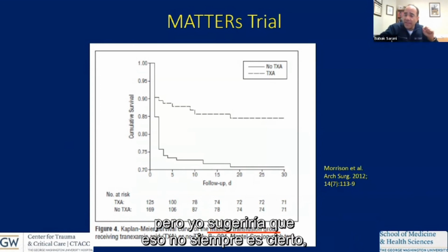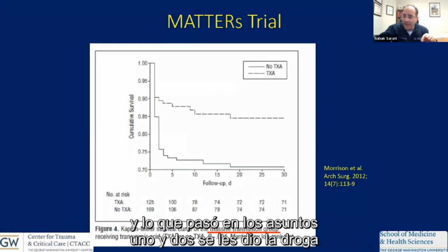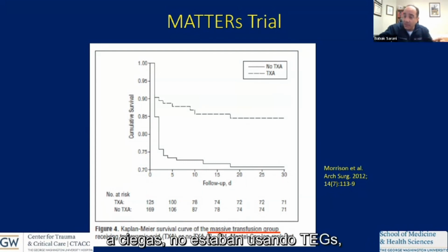But I would suggest to you that that's not always true. That's true if you're blindly dosing the drug, which is what happened in CRASH 2. Now, what happened in MATTERs 1 and MATTERs 2? They were given the drug blindly. They were not using TEGs. We give the drug in a directed fashion.